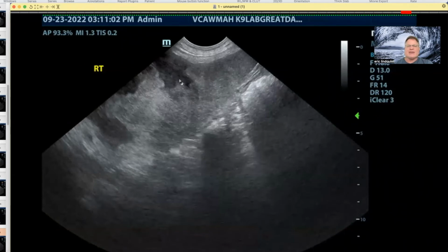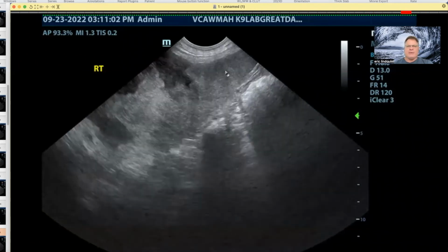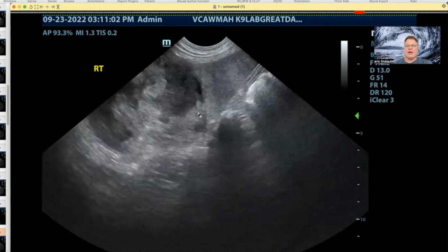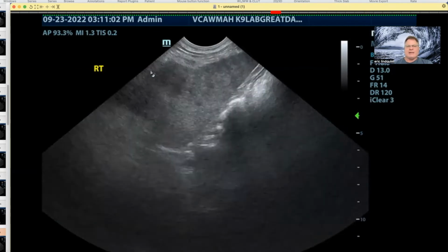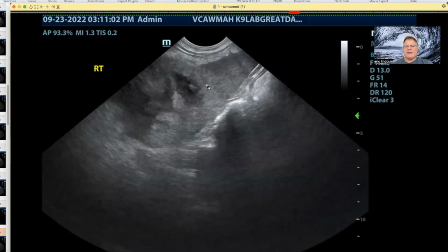So you know that is continuous with the splenic parenchyma as opposed to contiguous, right? And so we know that is a splenic mass because it belongs to the spleen. The capsule goes around it, and the splenic architecture dives right into it without getting separated by another organ capsule or the splenic capsule itself. So it's all about following the lines. You see the capsule goes up around the mass itself and then gets nebulous because of the adhesions going on. But there's no organ capsule separating the mass from the internal parenchyma of the organ of reference.